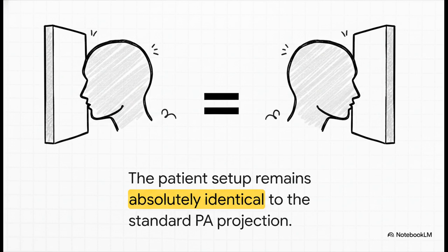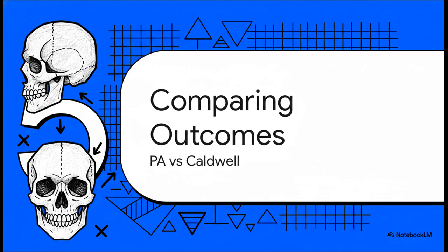10 by 12 vertical collimation, prone or seated upright, mid-sagittal plane centered, nose and forehead resting on the IR, neck flexed to make the orbitomeatal line perpendicular. The baseline rules we established earlier still apply perfectly here. The patient doesn't move a muscle, only the machine moves. Let's move to Section 5 and see how this builds our understanding, comparing final outcomes.